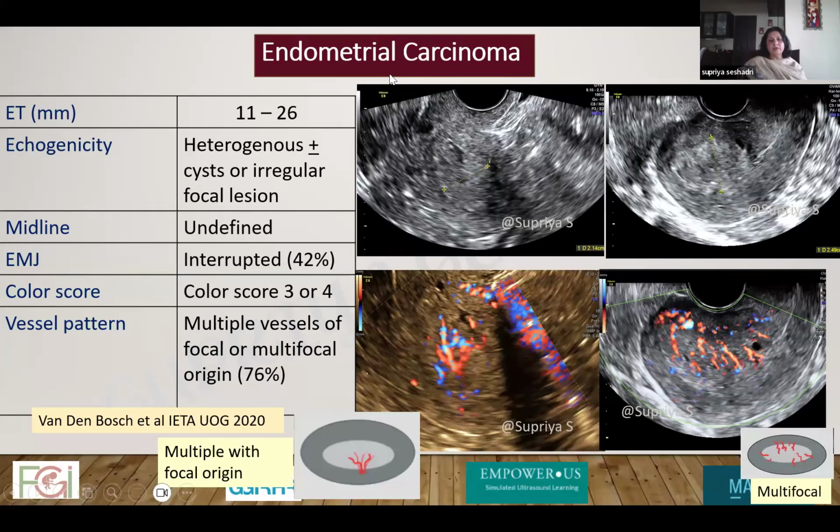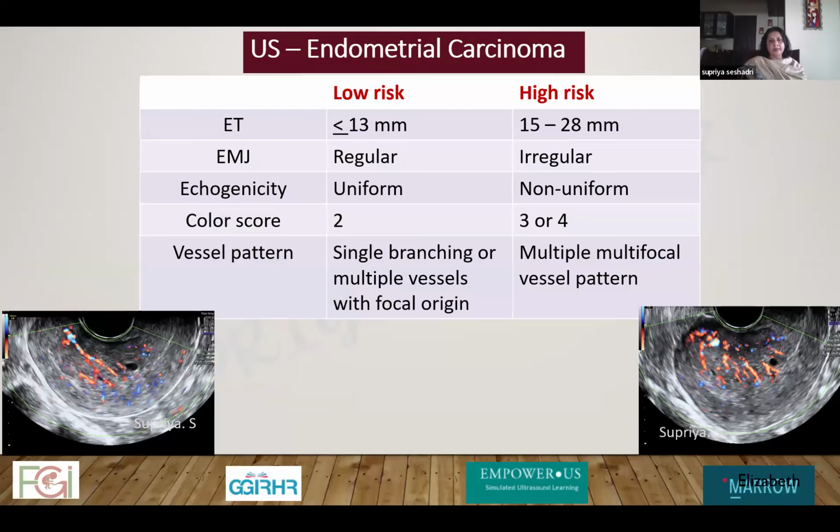Two patterns again, here called multiple vessels of focal origin or multiple vessels of multifocal origin. You can have either of these two patterns when it comes to endometrial carcinoma. Ultrasound can also tell us whether it's low risk or high risk. Now, these were the findings by Elizabeth Epstein.